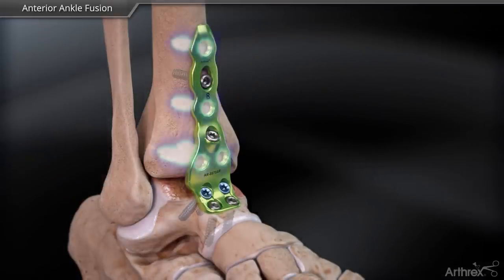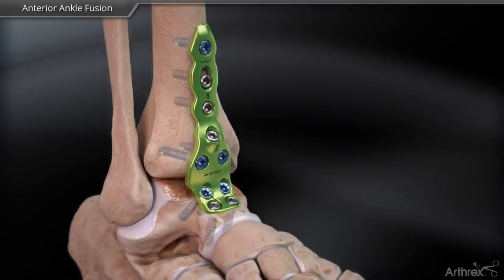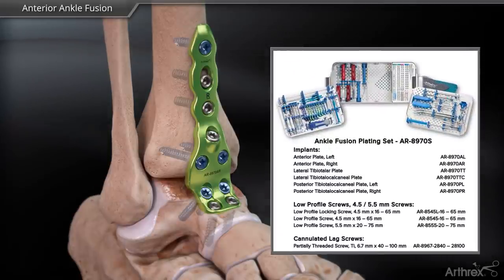Continue to use either locking or non-locking screws through the remaining proximal plate holes until the desired fixation is achieved.